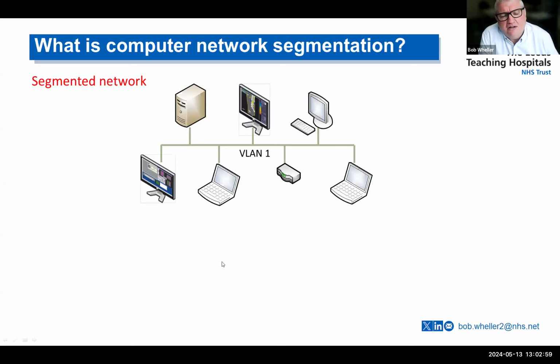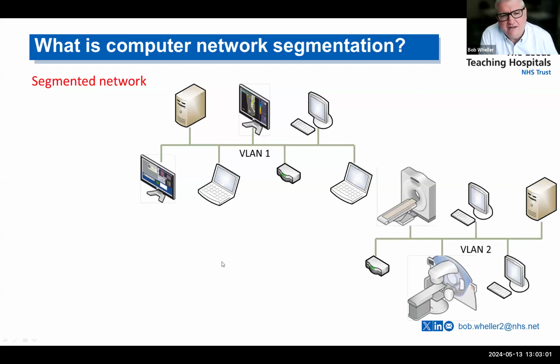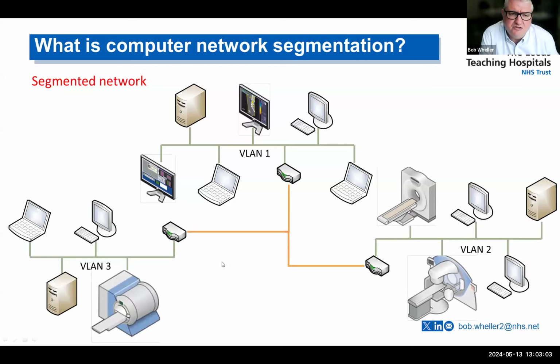But if we've got network segments that are split up and then connected together through routing, to some extent, when we get the malicious software sat on one of these computers on that network segment, if we've got critical medical devices mixed in with normal IT systems, then that malicious software, although it might only learn from part of the network, is still going to learn about some traffic and some communications that we really don't want to be exposing to it.